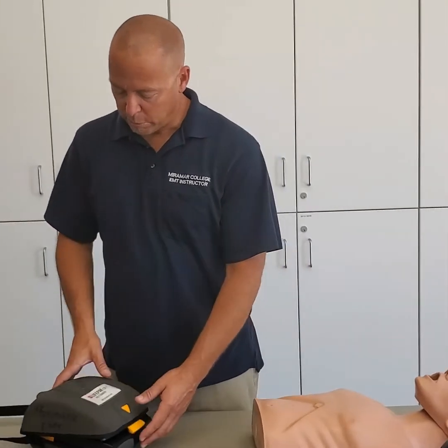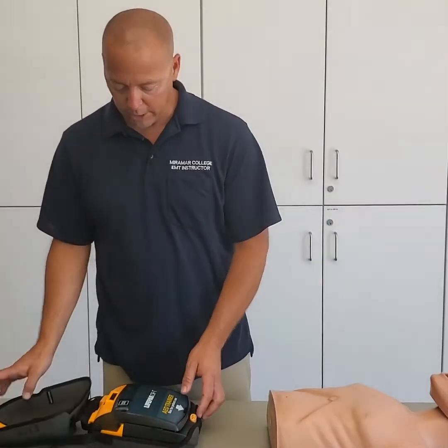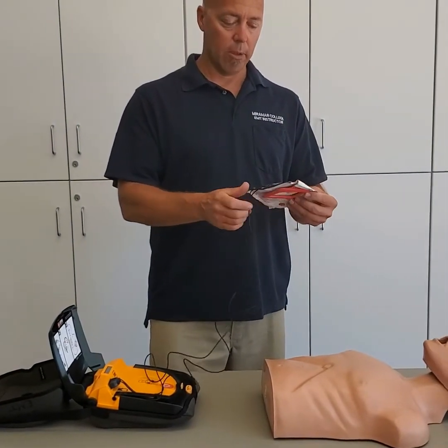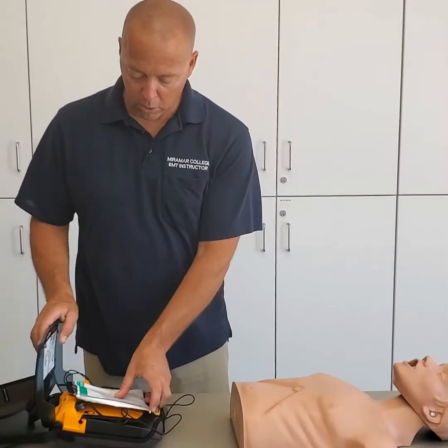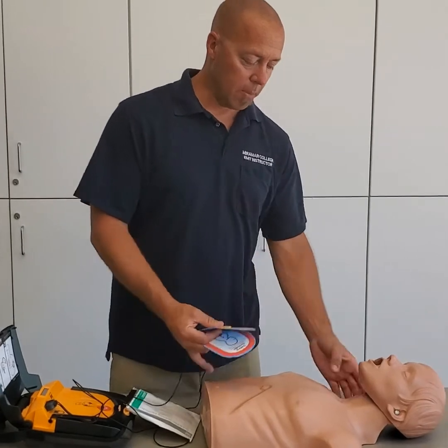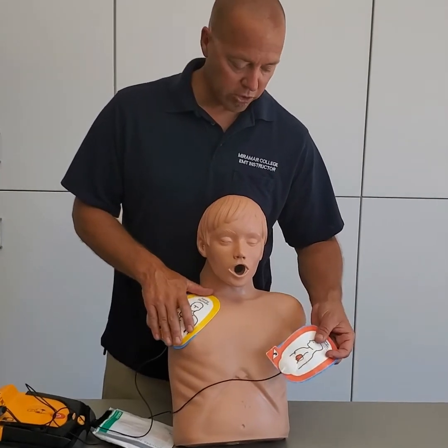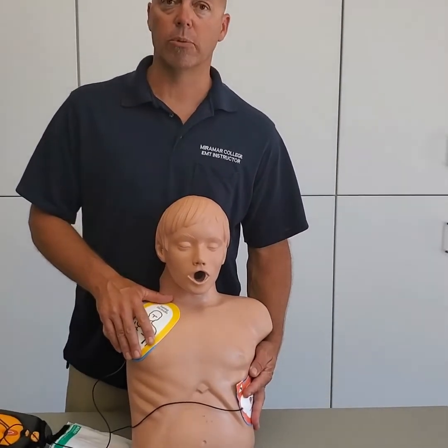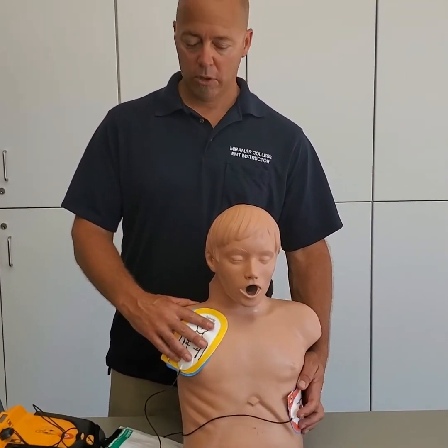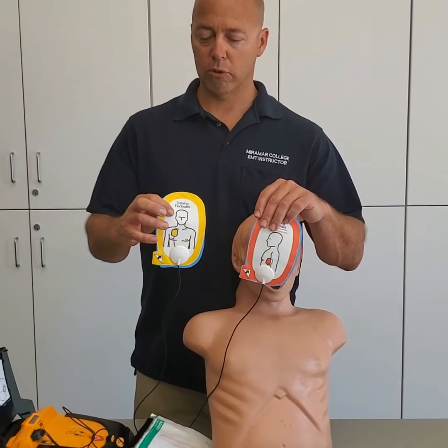All right, a couple of things about this machine. When we put these pads on, let's just open this up. You have these pads here, and they must go on your patient in specific positions. They have little pictures on them. One is going to be on the upper chest area, and one on the lateral ribs area. So it's always the patient's upper right chest and then the left lateral ribs. That is how your pads have to go on. If you forget, most pads have little pictures.